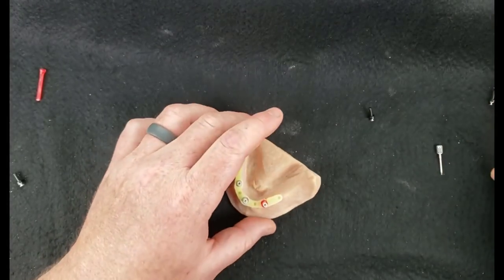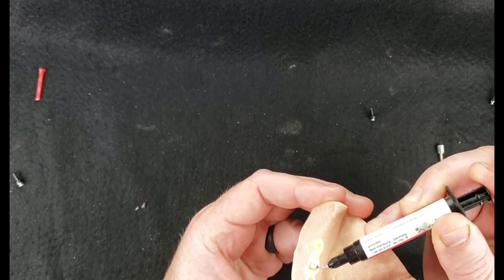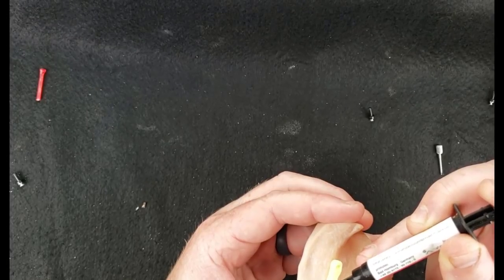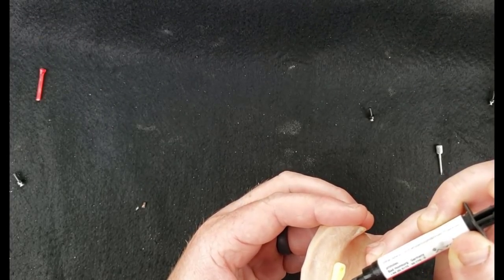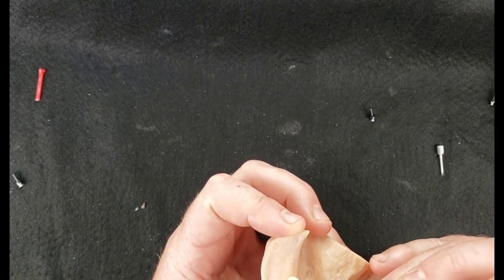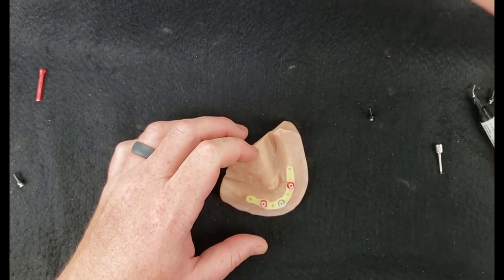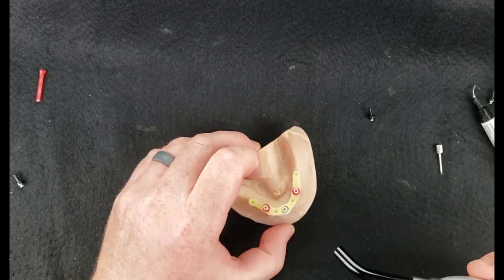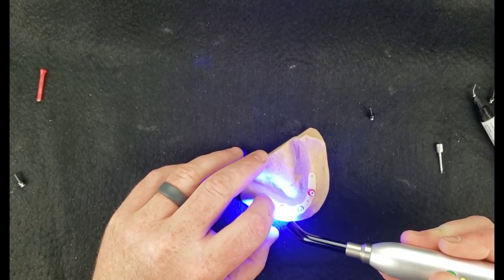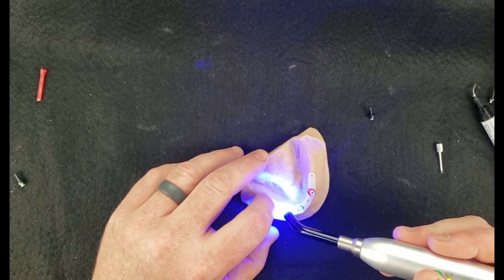Alright, so we've got one of those picked up. We could now take some more Primo pattern and squirt in the gap between our printed frame and the UCLA abutment. Alright. And again, even though these are dissimilar materials, they're both castable resins, and so you'll be able to simply pass this off to your lab to invest, and then they will cast this object all together.